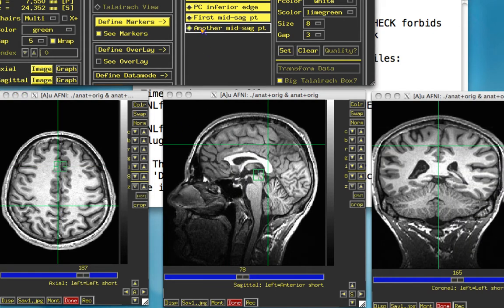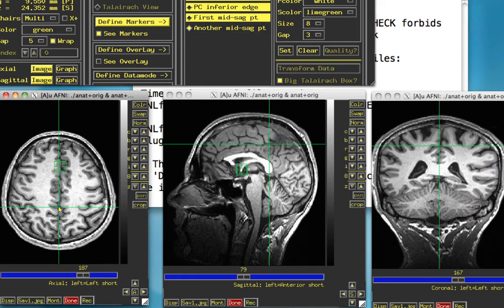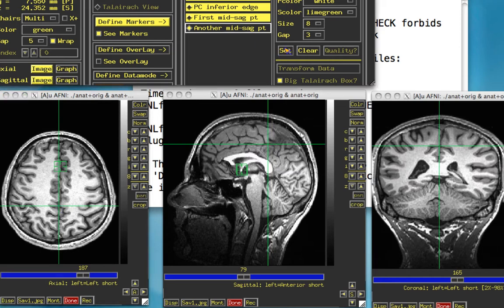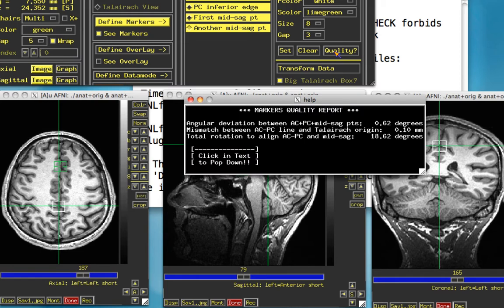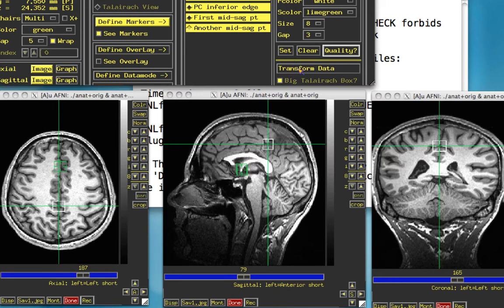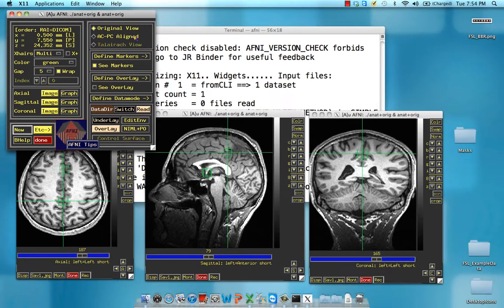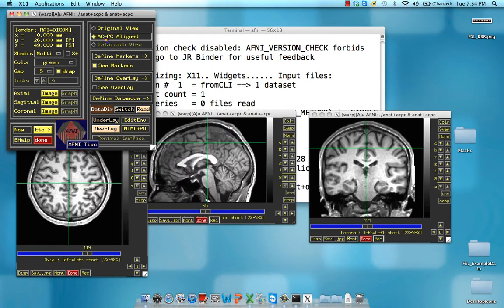This is a good teaching moment — I forgot to select the radio button before setting the other point, so I need to redo that. It doesn't matter what order those sagittal points are in. Once you're done, click on the Quality button to get your marker's quality report. If there is more than about a two-degree angular deviation between these two planes, it will give you an error and will not allow you to transform. Once everything looks good, click on Transform Data to compute and transform it into the ACPC-aligned plane. Then click on the ACPC-aligned radio button.